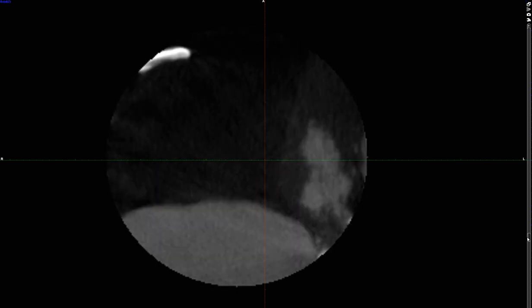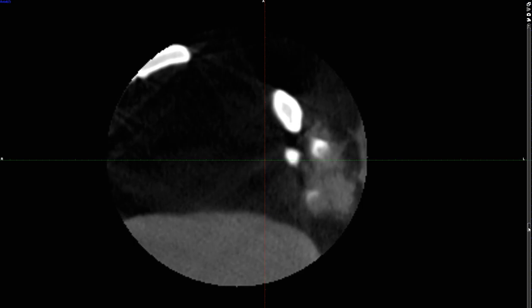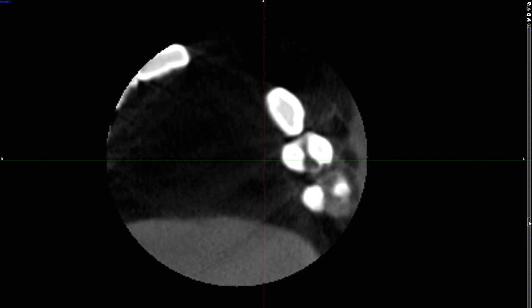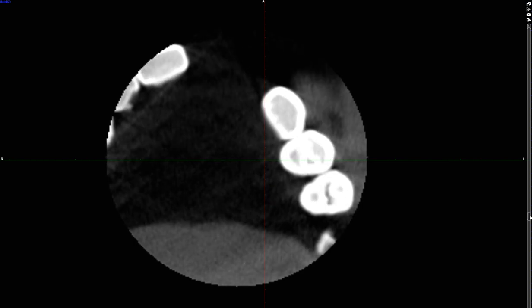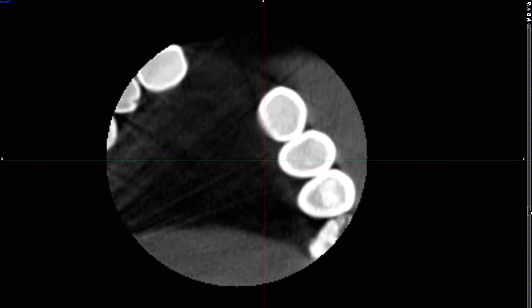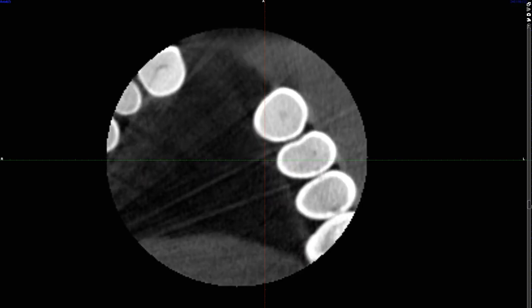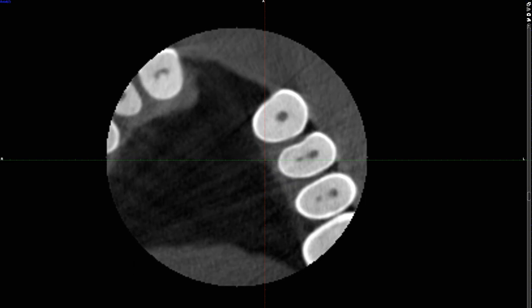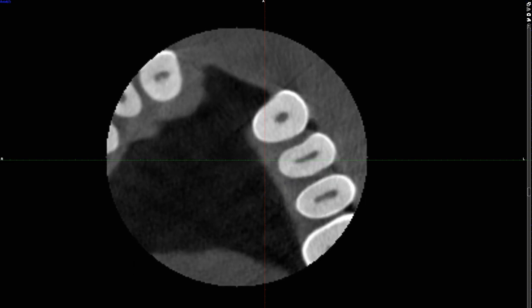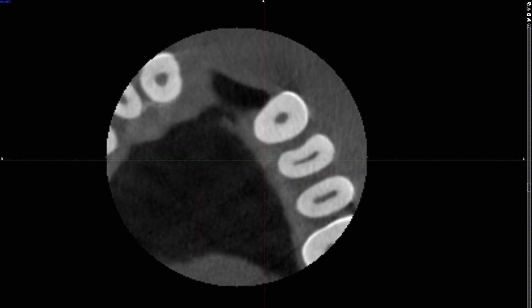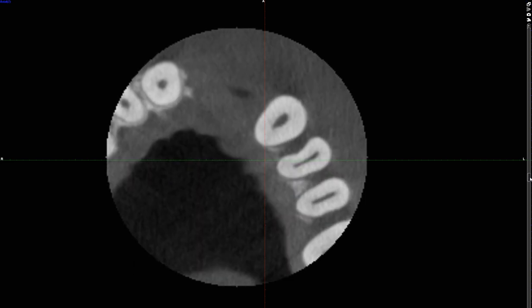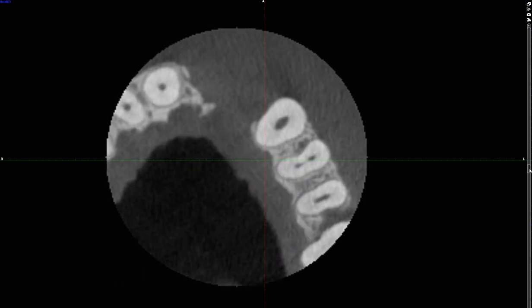So which tooth clearly demonstrates the proximal caries? And why was this taken?